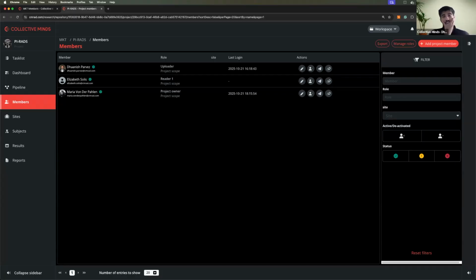Thank you, Maria. Yeah, that definitely adds another layer to understanding and tracking your data. So that's definitely great to see. Back over to you, Ellie. And again, the same question. Why was this feature in this new update, and what issues did we have before that now will be resolved by this?